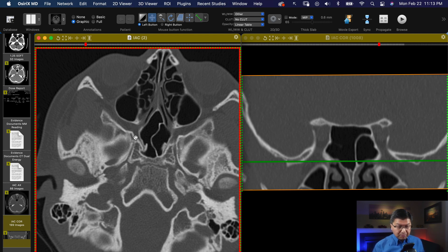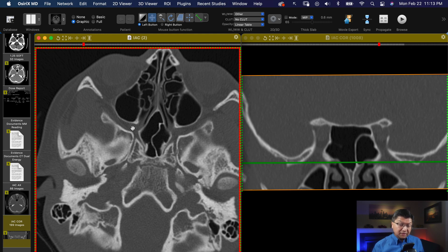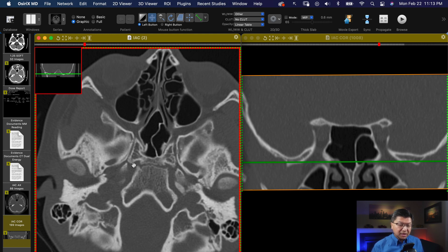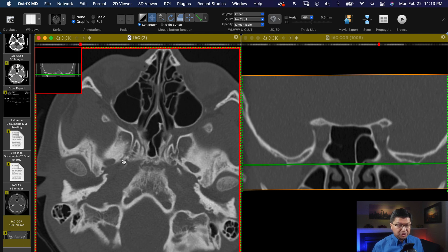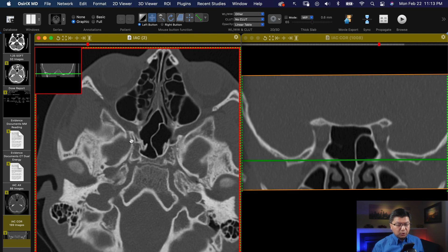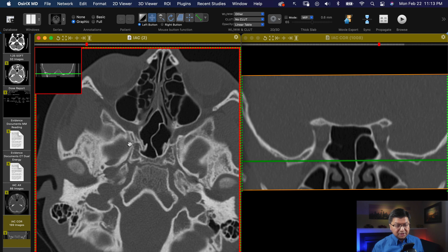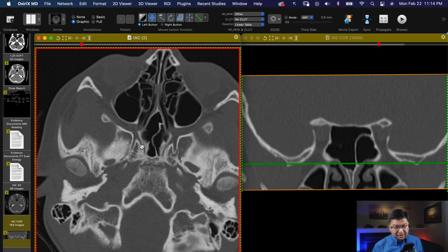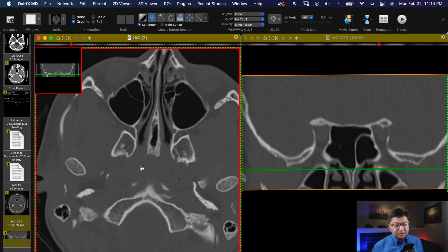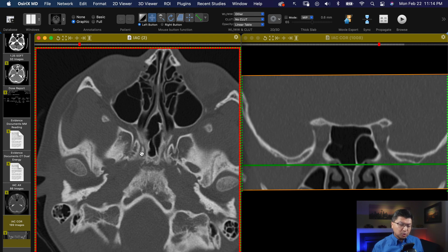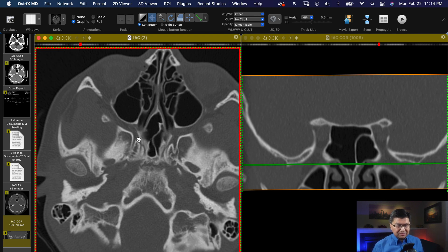Staying at the same level and coming back to the region of the pterygopalatine fossa, you've got this structure — that is your vidian canal. The vidian canal is a way for structures from the pterygopalatine fossa to communicate with the foramen lacerum or the carotid canal. You can see it going right into the carotid space. More medially, it empties out as two separate channels going into your nasopharynx — that's called the pharyngeal canal. This person happens to have one canal that bifurcates into two smaller canals, but sometimes you can have a single canal going back there.